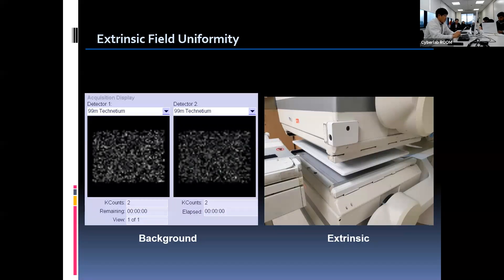When the flood sheet source is ready, we do the extrinsic uniformity test in the morning before starting clinical patient imaging. Prior to acquiring the flood source image, we need to check the background in the room with the same detector first. If we confirm that there is no other radioactive source in the room, we can proceed to the next step. The flood sheet source is placed right on the collimator while maintaining the same distance from the detector as described in the image. Approximately 10 million counts need to be acquired, and it takes around 10 minutes with a 10 mCi flood source.